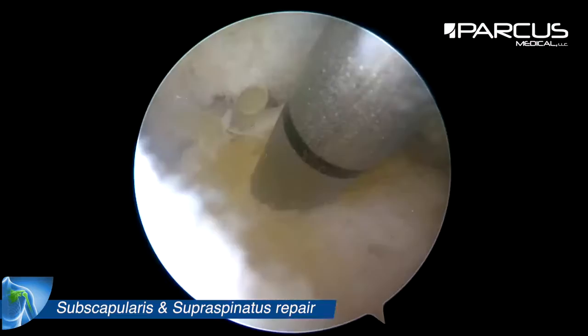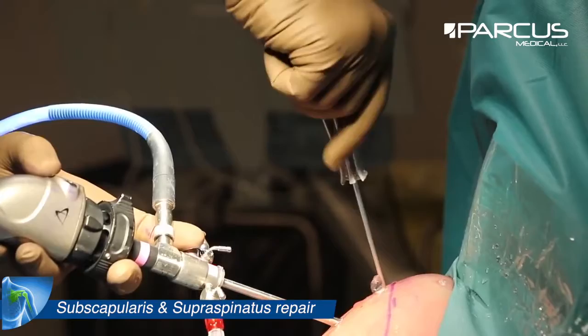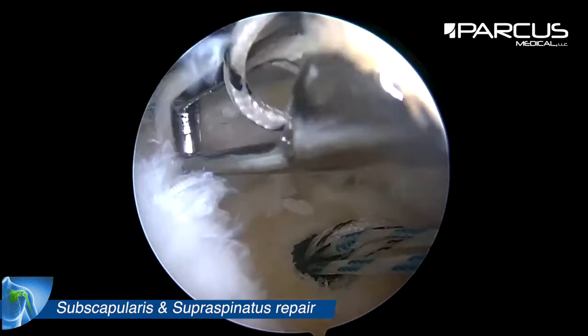Now let's focus on the supraspinatus repair. This is a full thickness tear and we have debrided the bone. Then we insert a screwing anchor close to the cartilage.